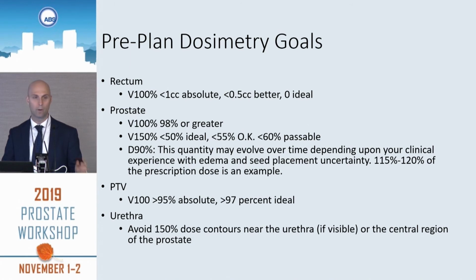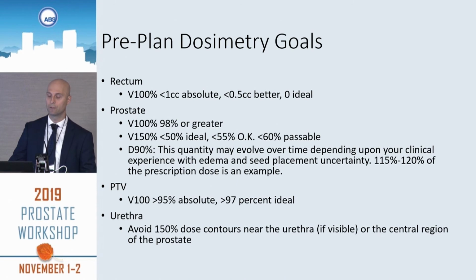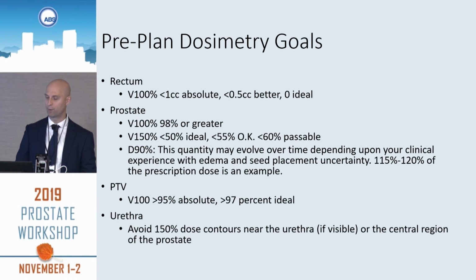And then urethra, our pre-implant imaging doesn't have a catheter. We don't catheterize the patients for that. So we just try to avoid dose within a central region, and I'll show you some of that in what I'll call the pro tips.